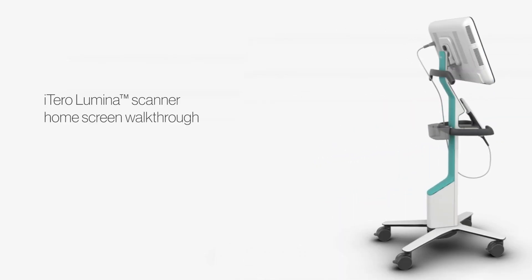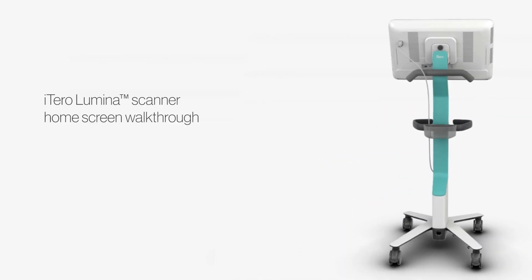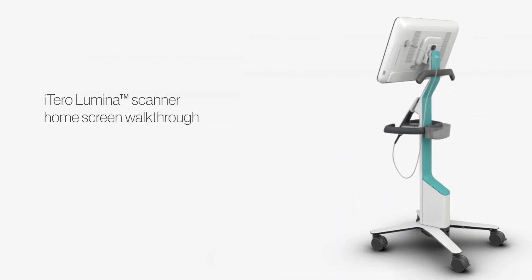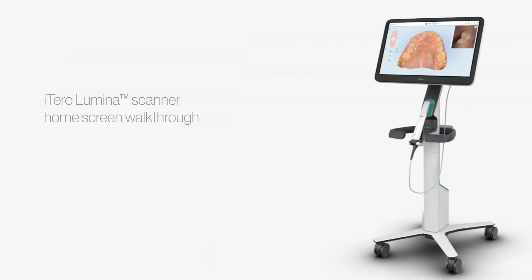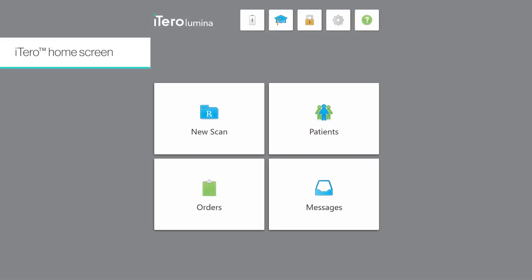Let's get acquainted with the iTero Lumina software and have a short walkthrough of the home screen functions. As you log into your account, the iTero home screen is displayed. Tap the new scan button to start the scanning process.